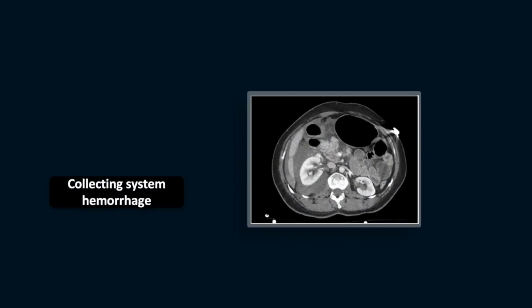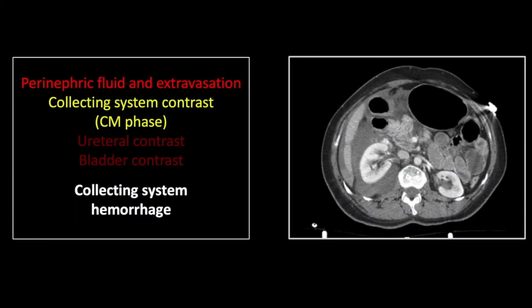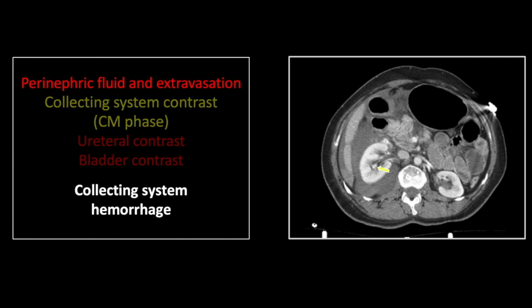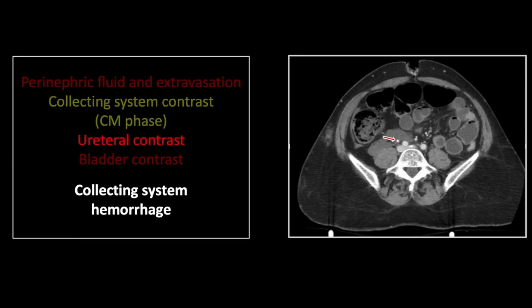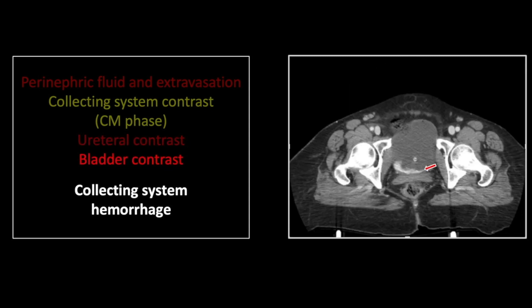Our next case is a variation of that — arterial hemorrhage into the collecting system, a different thing altogether but similar in appearance. You can see there is perinephric extravasation consistent with a laceration and a good deal of right perinephric fluid. Note also there is a hyperdense focus within the collecting system of the right kidney, yet the kidneys are not in the excretory phase, suggesting this hemorrhage is coming from an arterial source. There is contrast within the right ureter as well, a great deal of periureteral fluid, and dependent contrast within the bladder.